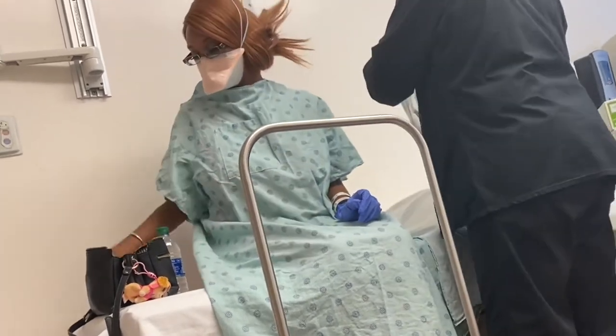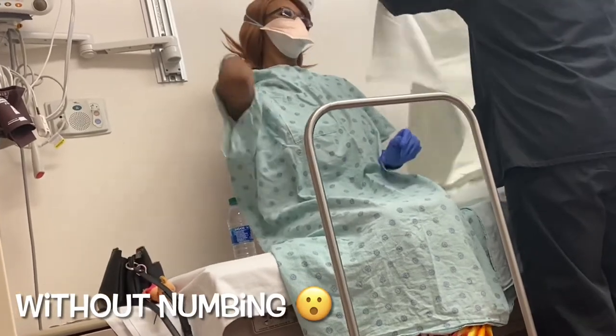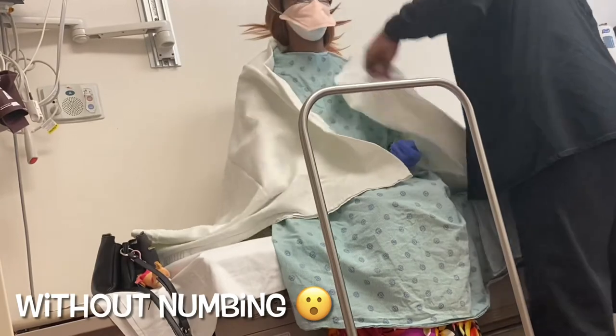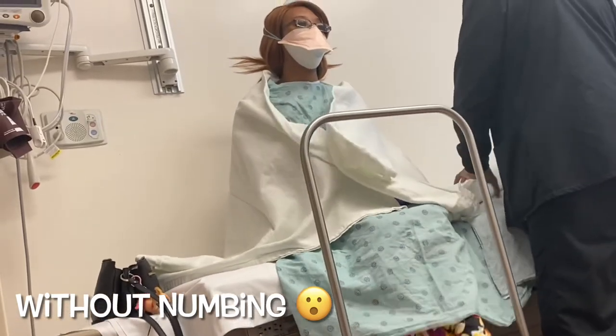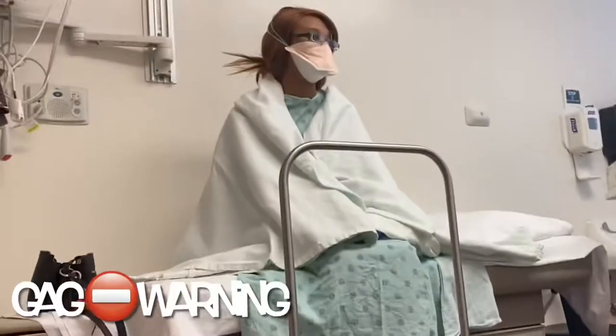What's the difference? It makes it feel like you can't swallow the numbing spray. Yeah. So what, will it hurt without it? You're gonna feel everything without it, yes ma'am. Oh man. Yeah. So we're gonna put the tube down. You might have some gagging, just be aware.